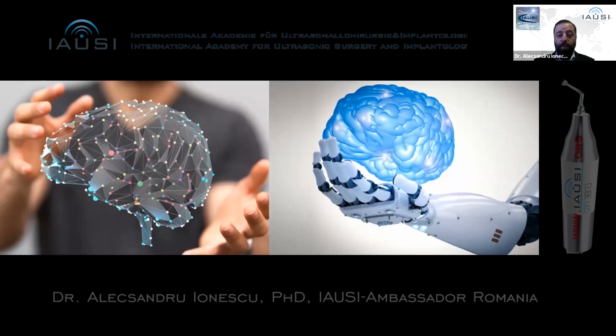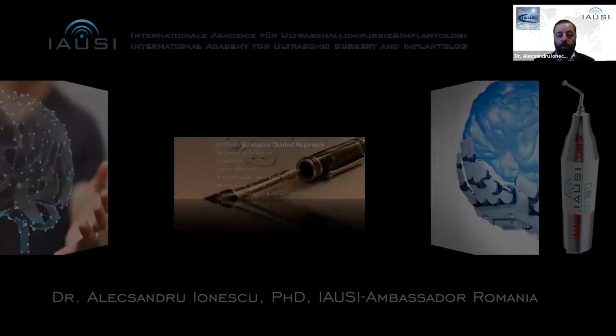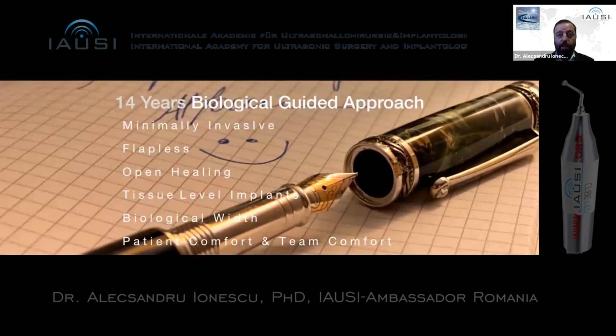But before that, we need to think biologically, to do the extraction as atraumatically as possible. And as you saw, with all these cases, we had these piezo surgery approaches. And our keywords, after 14 years of biologically guided approach, are minimally invasive, flapless implant placement, and open healing concept for socket preservation.